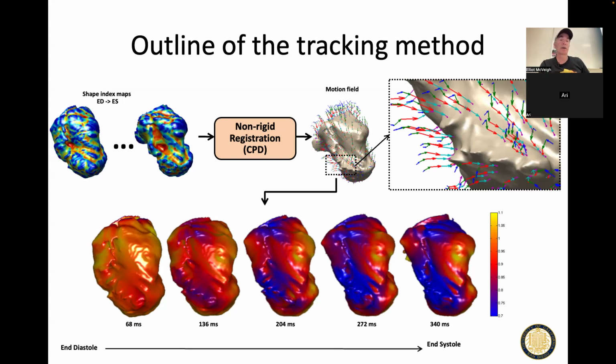We use it to map, say, the beginning surface of the left ventricle to what that surface looks like at end systole. So I have one surface here as a complex object, essentially represented by a cloud of points that have been segmented out on the surface of the left ventricle. Then at a later time, it's distorted, and we calculate what that displacement is to go from here to, say, here, which is end systole, and all the times in between.